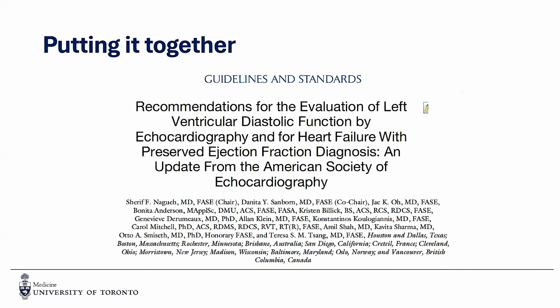So putting it together, I'll spend the last 5 minutes talking about the actual guidelines themselves, which were updated last year in July of 2025. The previous guidelines were published in 2016. And the whole purpose of the guidelines is to try to reduce the number of people that were previously classified as indeterminate diastolic dysfunction. Such that now, if we go through the current guidelines, understanding the key caveats, almost nobody will ever be classified as indeterminate diastolic function, and quite few people are going to require invasive or exercise echocardiography to assess diastolic dysfunction.